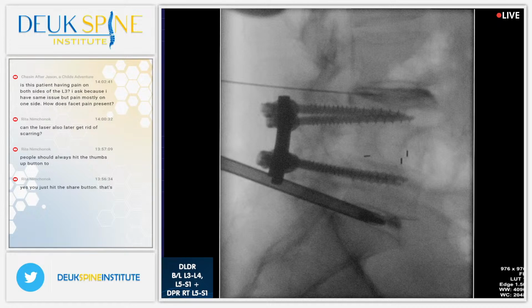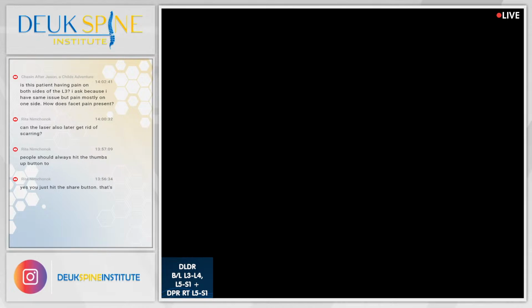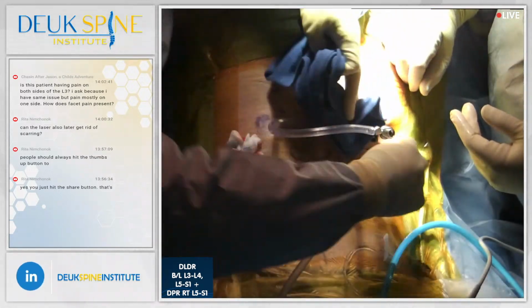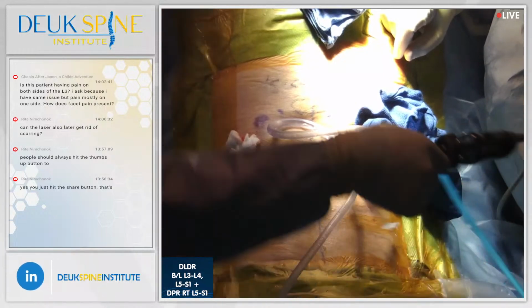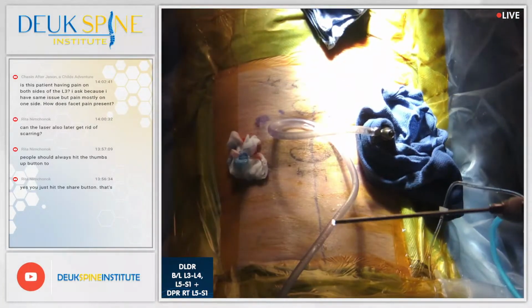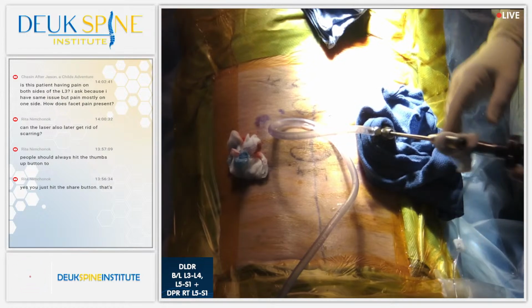People ask me, why do you use the hammer? The answer is it's the safest instrument to use, given the circumstances. See, if you try to push the tube in with your hand, you could push too hard and suddenly resistance goes away and then you're pushing it in way too deep. With a hammer, or mallet as surgeons call it, you can control the amount of energy each time you hit it. Any questions?